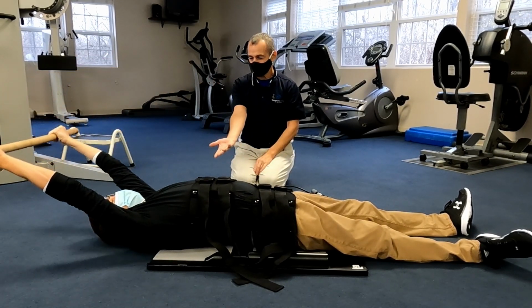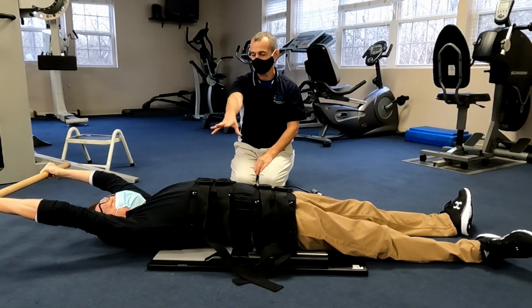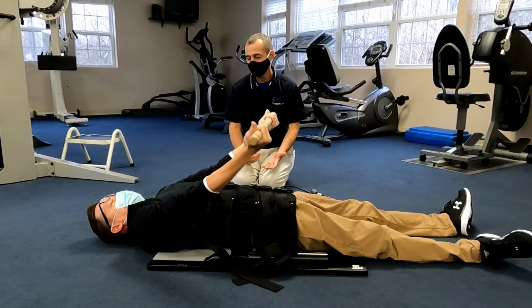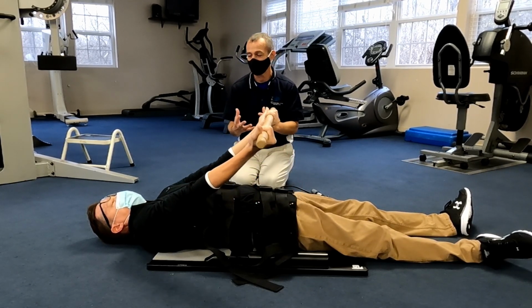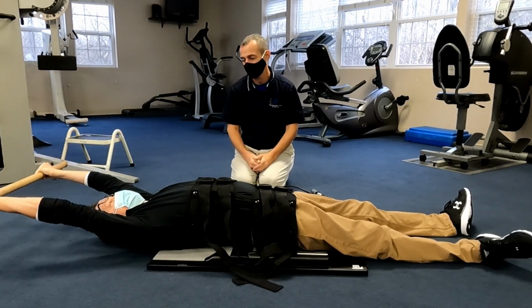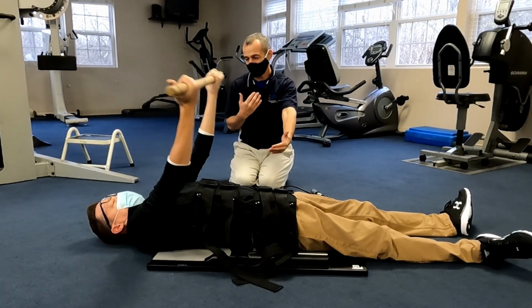So we get the lateral rotation through the humerus, we get the lumbar extension, we get the diaphragmatic breathing, we get the thoracic expansion. We really just get a little bit of everything, you know? And so the whole idea with this, for me as a therapist, is that this isn't a device to just lay on for 20 minutes and close your eyes. You can, but I would take it up a notch.